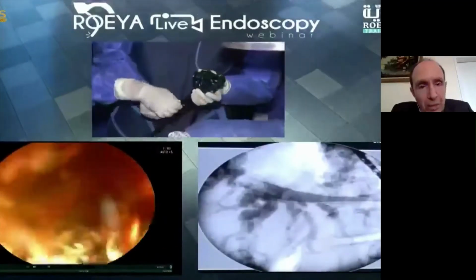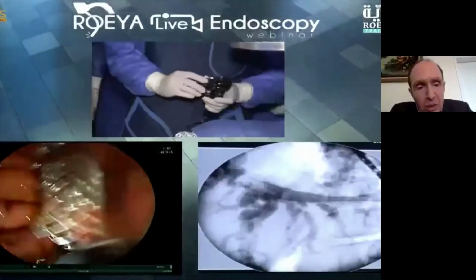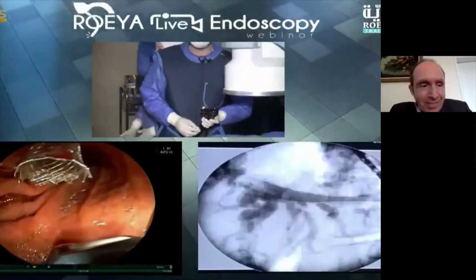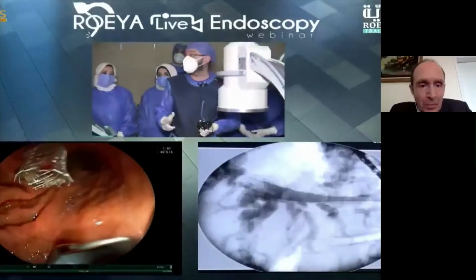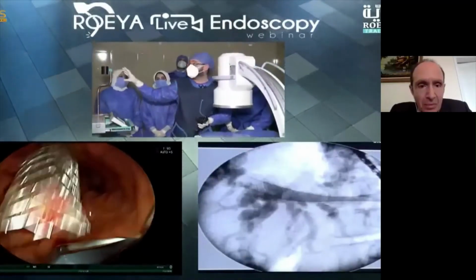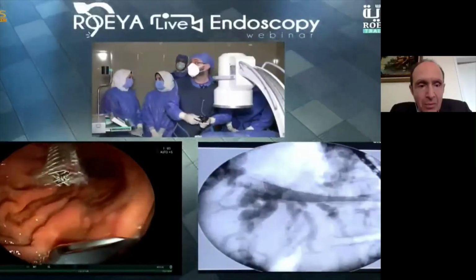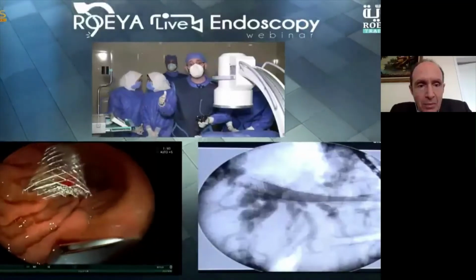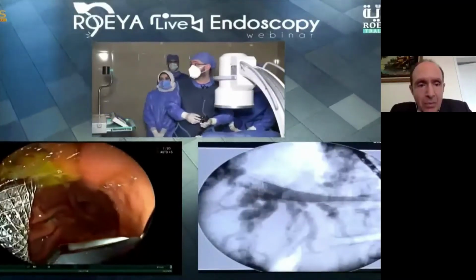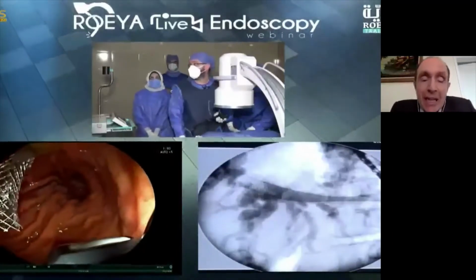Some prefer... Would you consider putting a small pigtail stent just to... Yes, this was the question I was asking. Some professors prefer to put a double pigtail stent to prevent further migration, or despite using a stent with a distal large flange to avoid migration inside the stomach, inside the liver. But most experts nowadays don't see an advantage of putting a double pigtail stent to avoid further migration. What's your opinion, Professor Fauzi? Do you prefer to put a double pigtail stent or not?